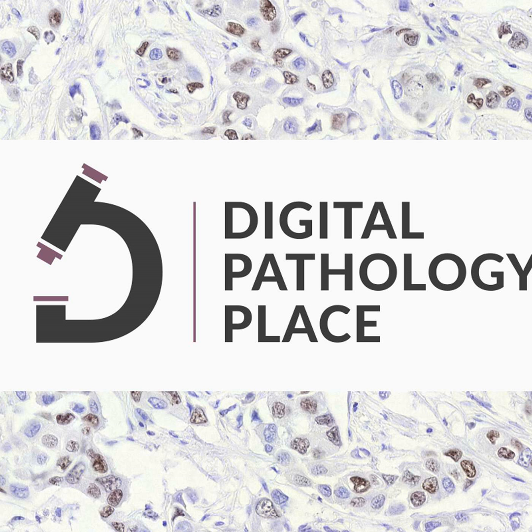Like I said, people buy an instrument for now, but I always say you should plan for the future because things always change. And with these, I would call them a tool, these scanners, people don't realize how useful they are and all the things they can do. You can digitize all the slides that come into your lab. Maybe you're doing consultation for someone and you have to send the glass slides back. Well, you can digitize the slides and have them forever.